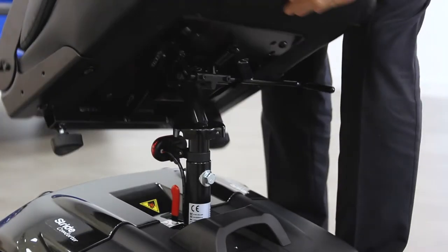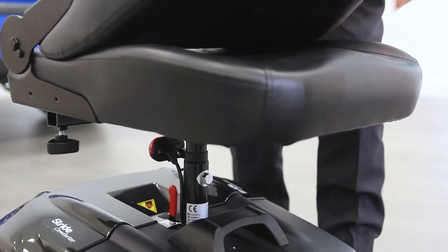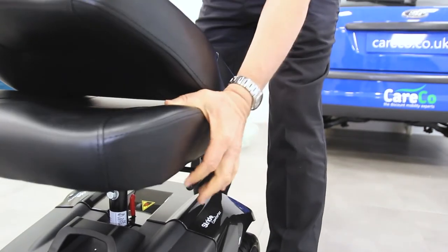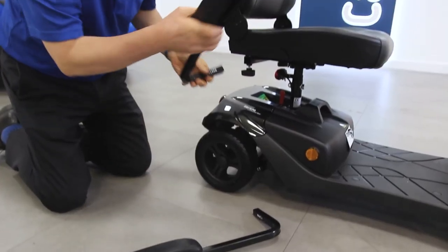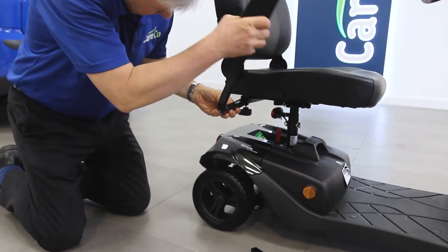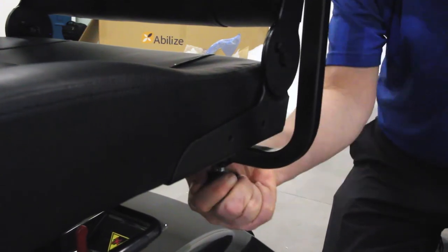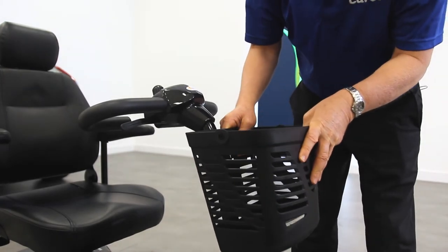Now drop the seat onto the seat post. Once in place, you should be able to swivel the seat from side to side, locking it in various fixed positions, all by using the handle underneath. With the headrest attached, you should now be able to add the arm rests. Slot them into the side of the seat then secure them by twisting the handle knobs on the rear. Finally, slot the basket onto the tiller using the grooves provided.